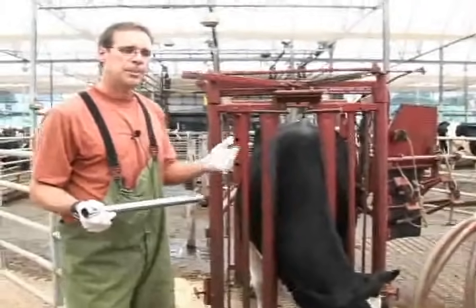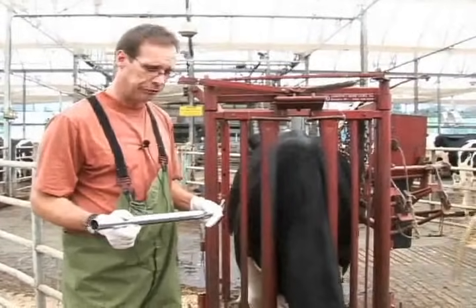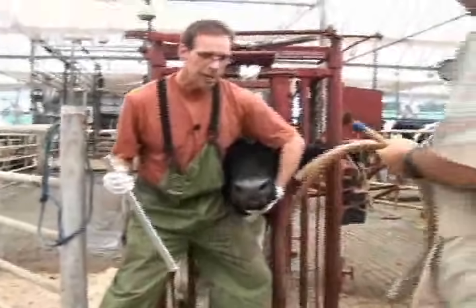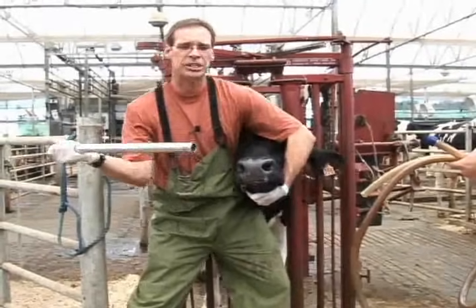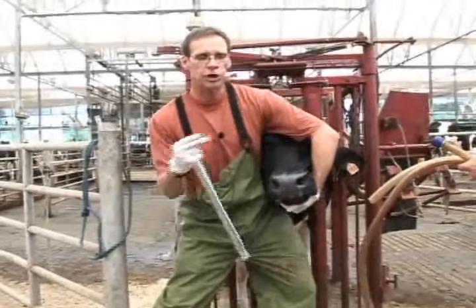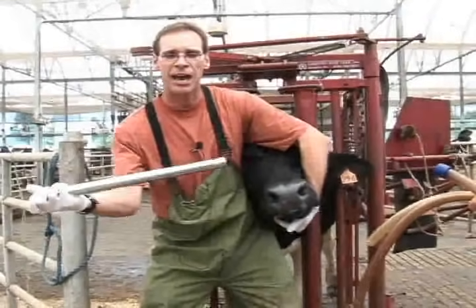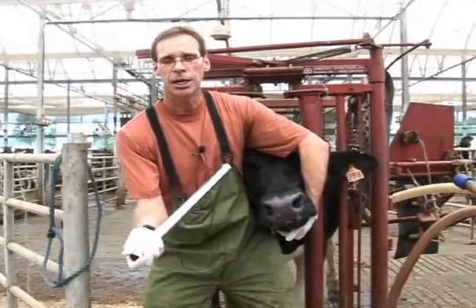Now we're going to demonstrate the passing of an oral gastric tube into this animal to supply and treat the animal with a very large volume of fluid. The first thing is to secure the animal's head in order to place the Frick speculum. Be strong, use your legs as leverage to balance yourself, and get up underneath the animal. Hold on to the Frick speculum at the very end to have the entire length to work with, in order to get it beyond the big ball on the back of the animal's tongue.